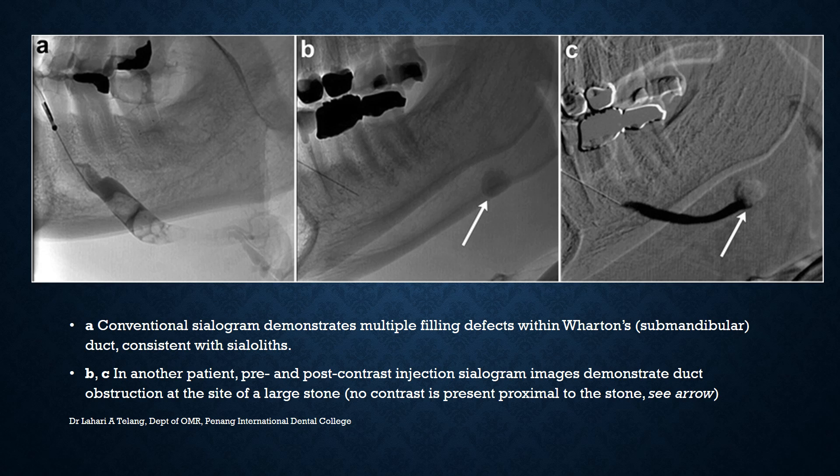A conventional sialogram demonstrates multiple filling defects within Wharton's duct in this image, consistent with the presence of sialoliths, as the stones obstruct the duct and prevent the dye from flowing smoothly into the gland. In another patient, comparing pre- and post-contrast injection sialogram images easily demonstrates where the obstruction is occurring, caused by a large sialolith.